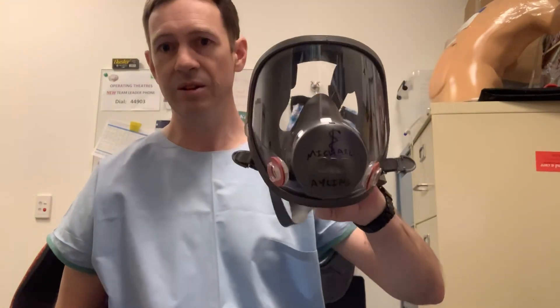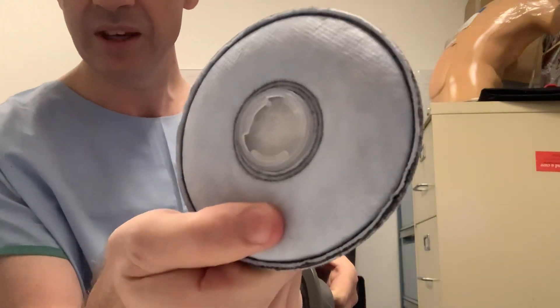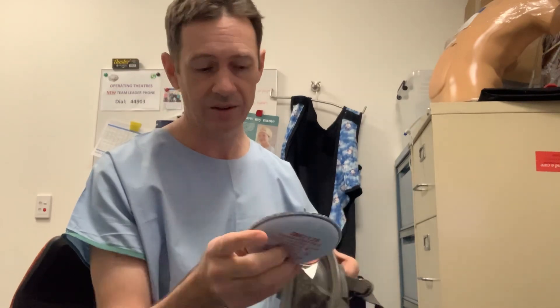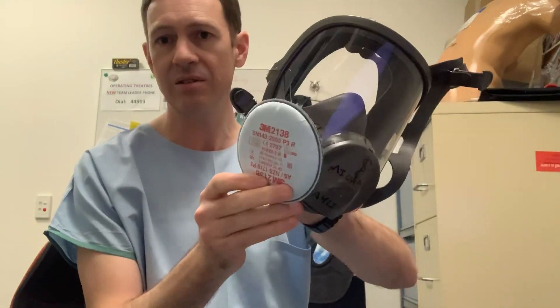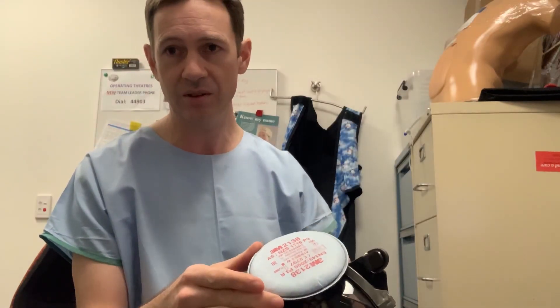Here's a respirator without any filters on it. You get hold of this bayonet fitting. Now this one has three evenly spaced holes, whereas the others all have one narrow and two wide lugs. You place it over here, press it down while turning until it locks. Now it's locked on. It's a wide exposed surface of fabric — I would consider this single use.